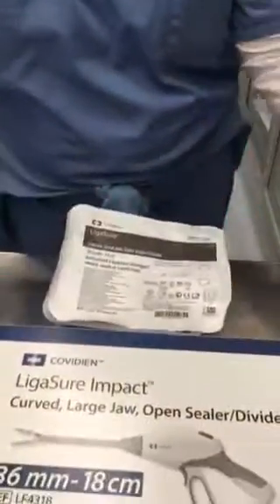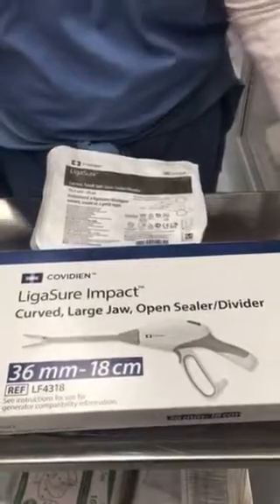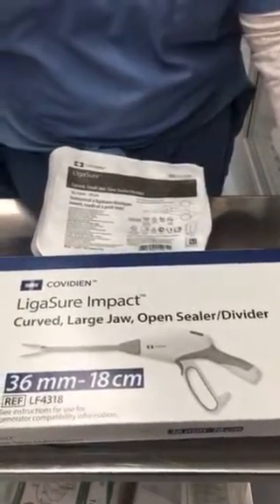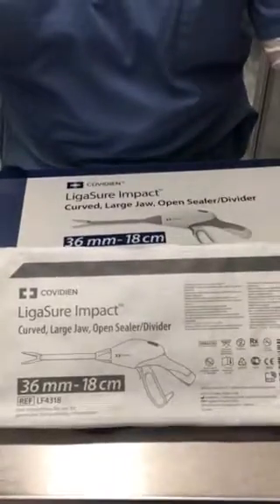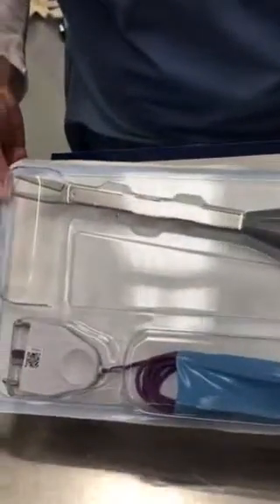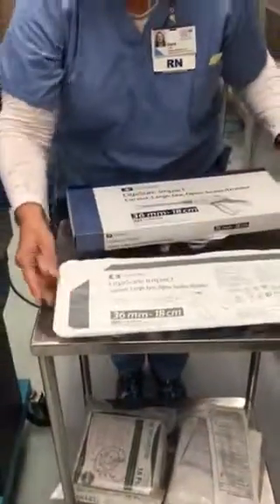The other one that sometimes we use is called the Ligasure Impact. It is for tying off bigger vessels. A lot of physicians like to use this for our hysterectomies. Here is what this would look like. And then on the back, you can see it's a much larger handle. It appears that my machine is now ready.